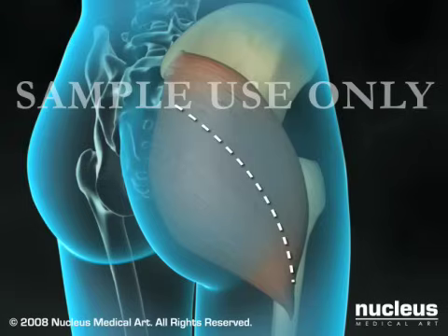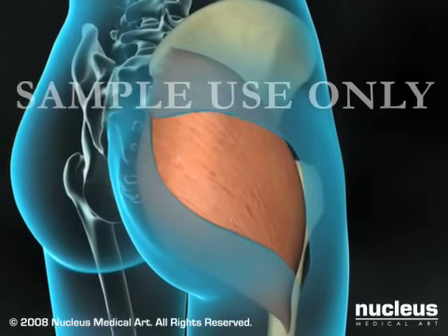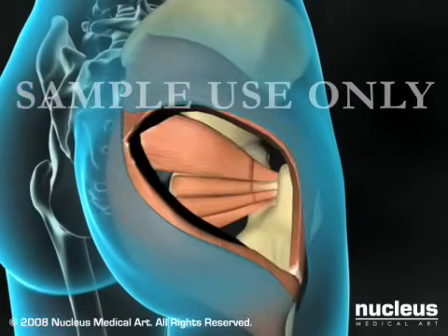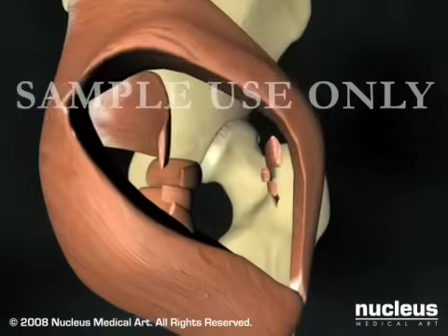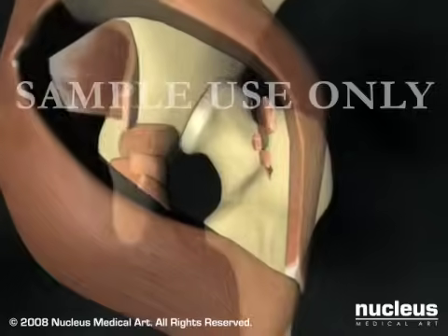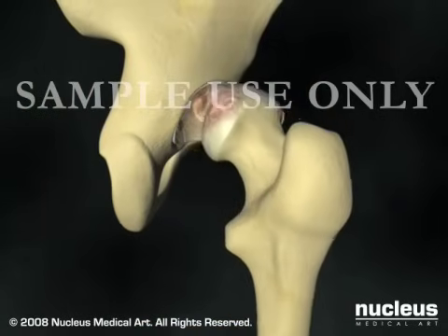Your surgeon will begin by making an incision overlying your hip, separating the muscles and ligaments to expose the joint capsule. After incising the capsule, your surgeon will dislocate the femoral head from the acetabulum.